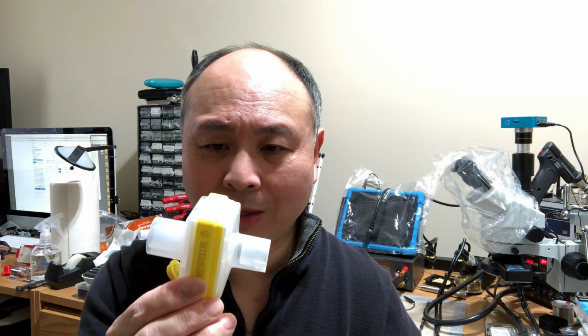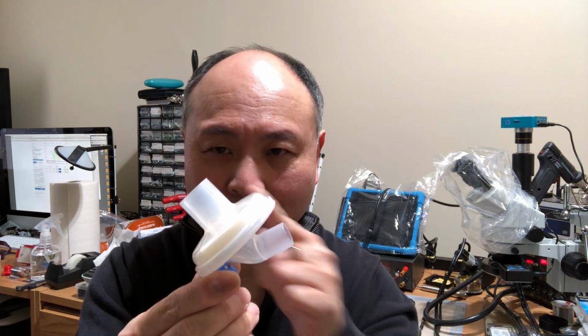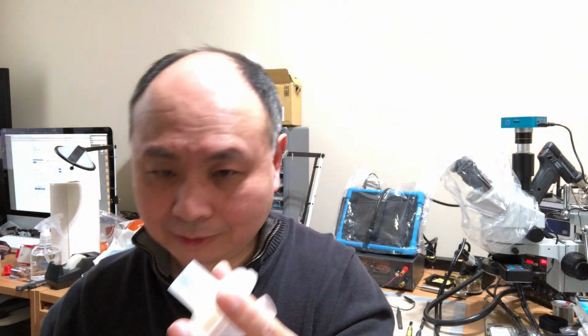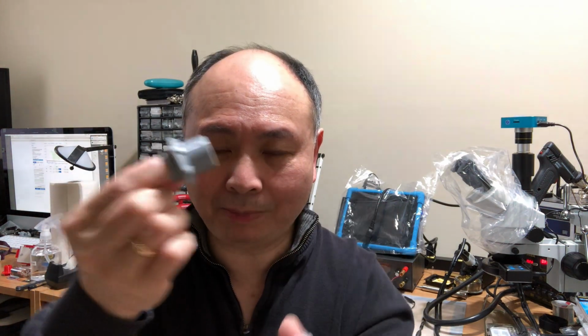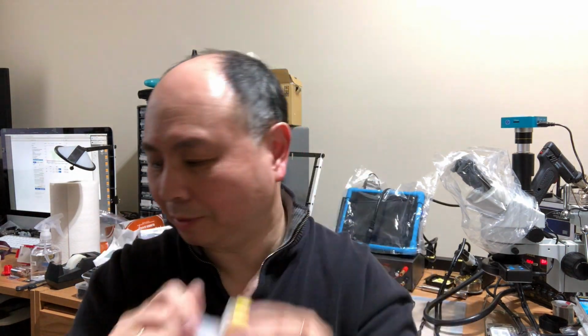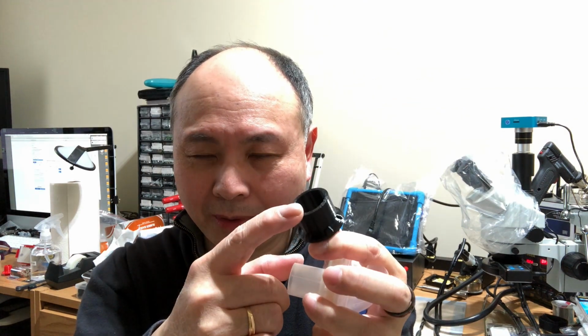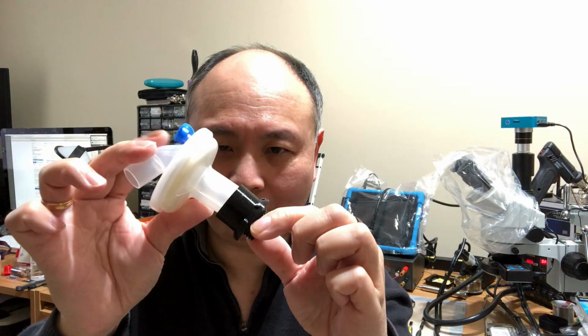One thing that I thought was standard in viral filters was having a male and a female, or inner versus outer diameter 22 millimeter ends. It turns out that's not always true. One of my colleagues in Portland, Oregon sent me, well, he had a problem getting it to fit because his HMEF has a 17 millimeter external diameter and a 22 millimeter external diameter, which does not fit the usual taper, because the taper is expecting a 22 millimeter internal. So the STLs now have a new 22 millimeter internal diameter fitting, which you can use as the alternative to allow this style of HMEF to fit into the system.